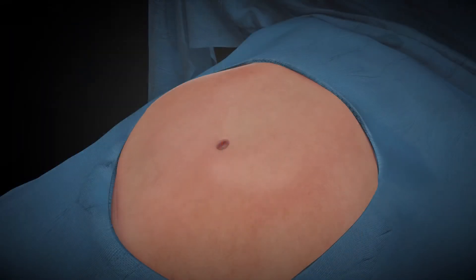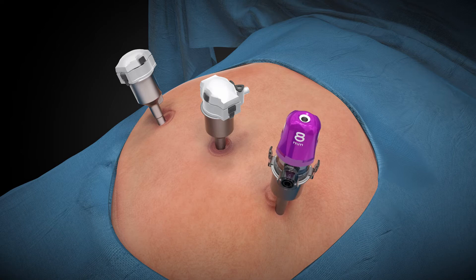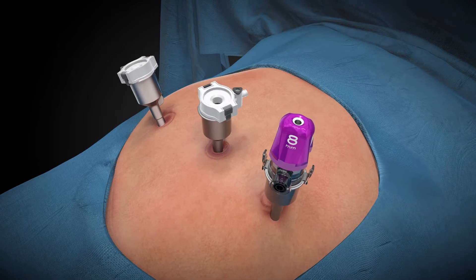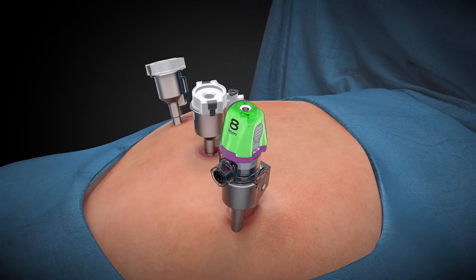Insert the robotic cannulas. It is recommended to place the cannula with the AirSeal cannula cap last. When you place the cannula with the AirSeal cap, be sure to keep the obturator in place until AirSeal is active.